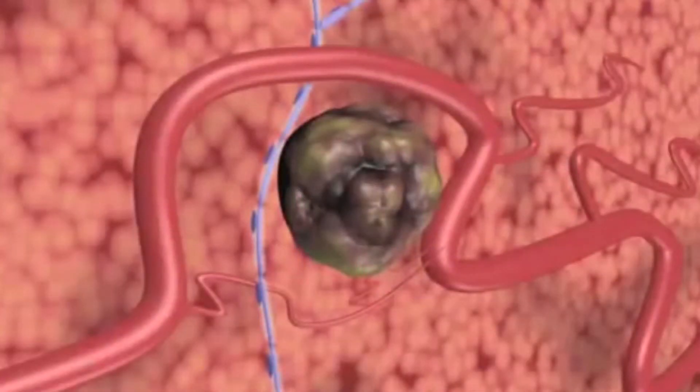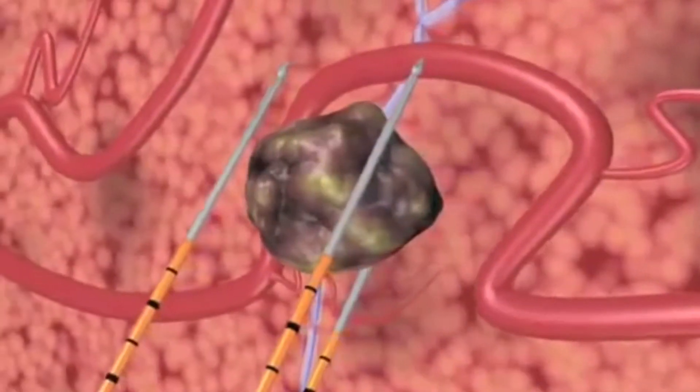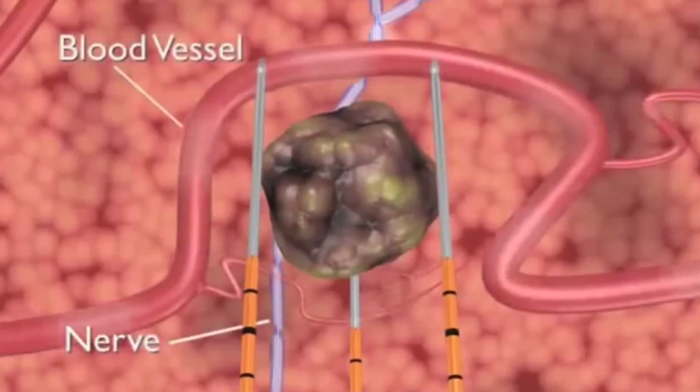NanoKnife IRE treatment induces cell death in soft tissue only. NanoKnife electrodes are placed in proximity to the targeted lesion, but unlike thermal ablation technologies, surrounding critical structures including nerves and blood vessels remain functional.